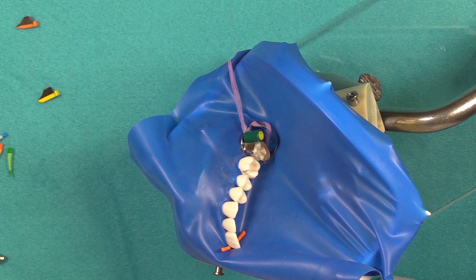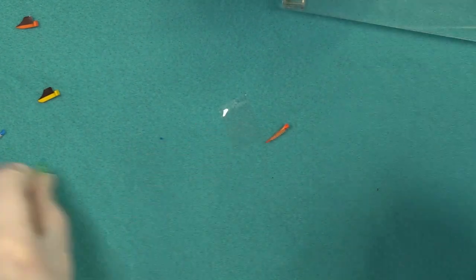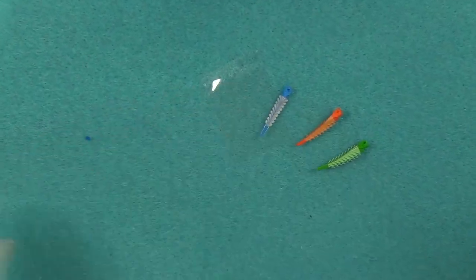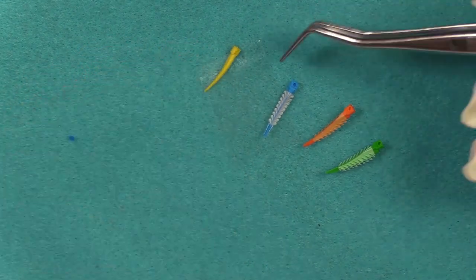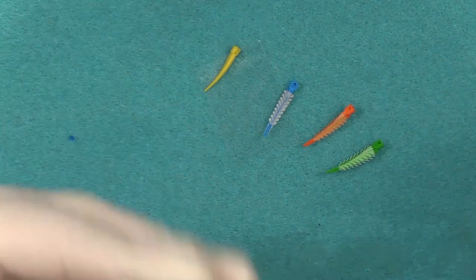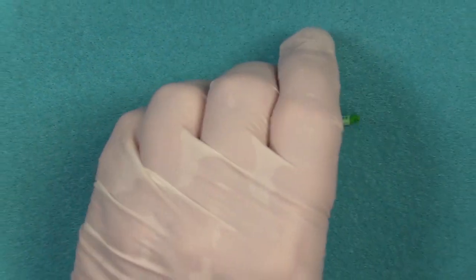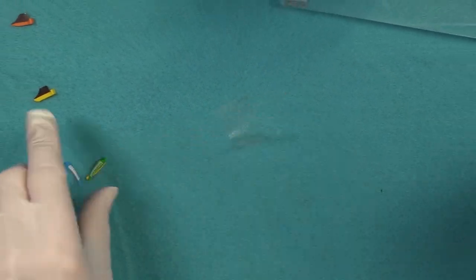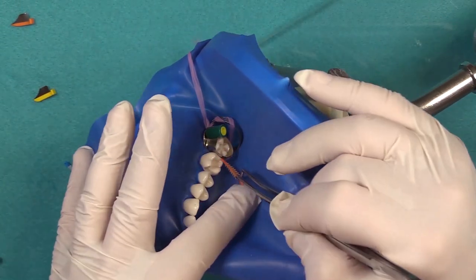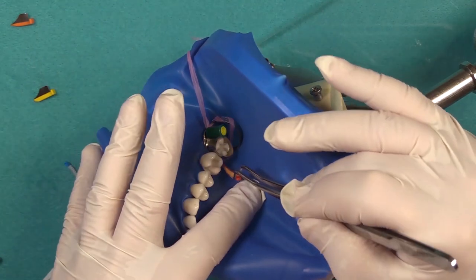Now let's talk about wedging. The next thing we're going to do is get our wedge. The wedges come in different sizes as you can see. Yellow is small and then you have progressively increasing sizes. You want to determine what size you need — I'm going to go with the orange for this particular case. We're going to insert this from the lingual.